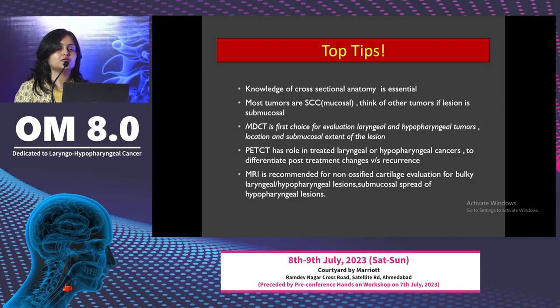PET-CT has a role in laryngeal and hypopharyngeal cancers to differentiate mainly post-treatment changes versus recurrence. MRI is recommended for non-ossified cartilage in evaluation of bulky laryngeal and hypopharyngeal lesions. It also helps in evaluation of the submucosal spread of hypopharyngeal lesions.